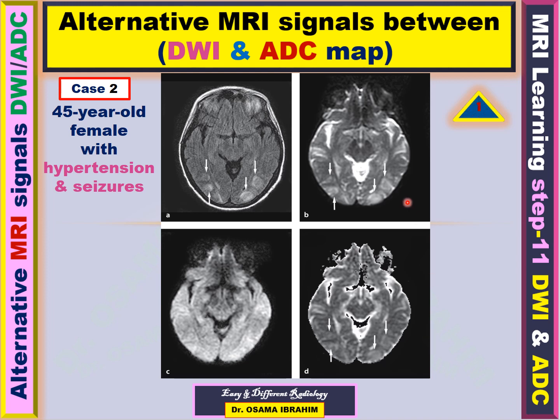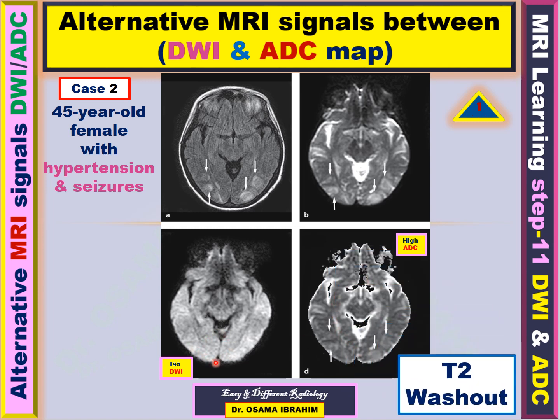This is the diffusion-weighted image sequence, and this is the ADC. The signal appeared high in ADC in the bilateral occipital lobe, and also appeared iso-signal in the diffusion-weighted image — slightly high but not as high as the ADC. ADC signal is higher than in the diffusion-weighted image. When iso in diffusion and high in ADC, this is called T2 washout, which represents edema.